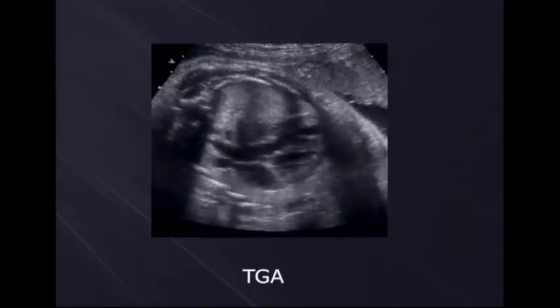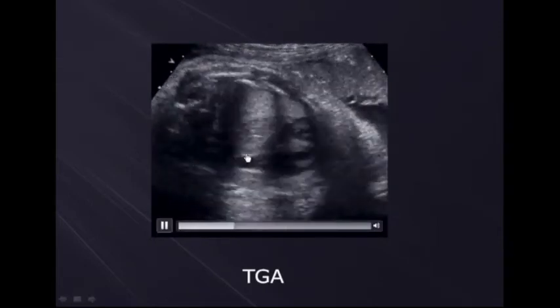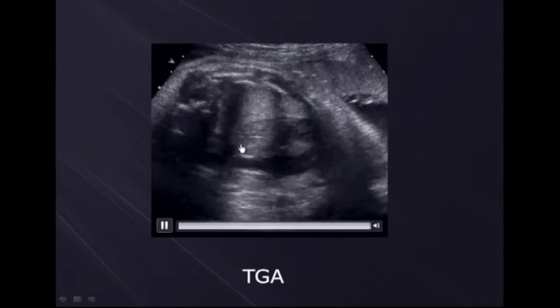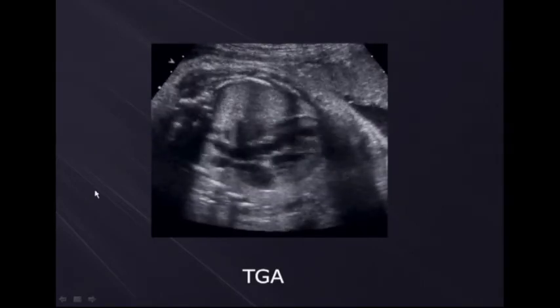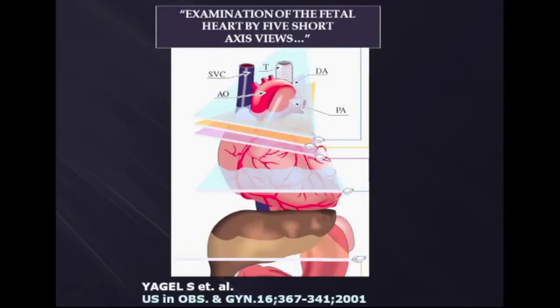Here it is in real time. The RVOT and LVOT are very close together, and you can see something coming out of the LVOT that does bifurcate. That's the pulmonary artery. Again, real-time images are important. Now, this 3-vessel view, it has 5 views. It was originally described by Yagel in 2001. We've been doing this view since about 2003 or 2004. Basically, if we can't get the normal outflow tracts, we always do this.